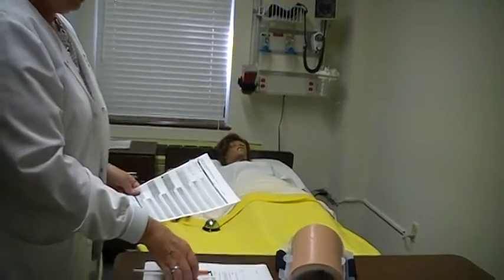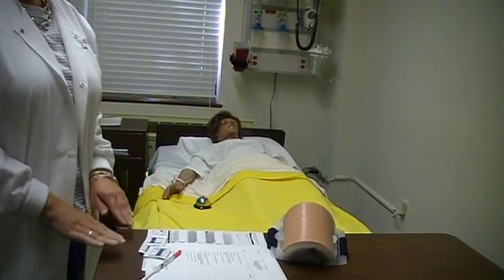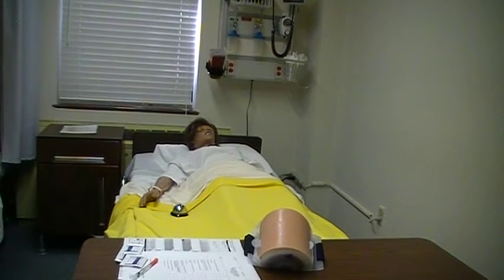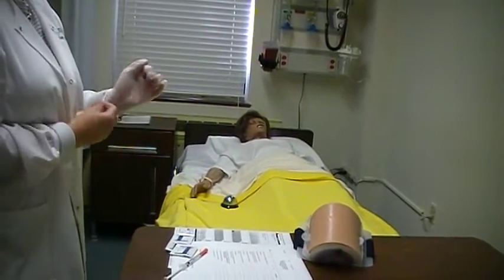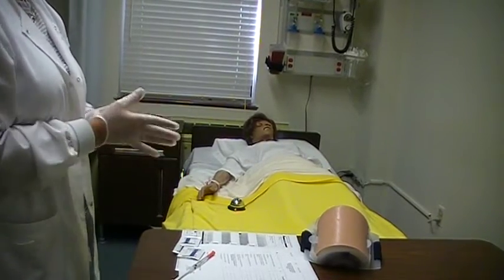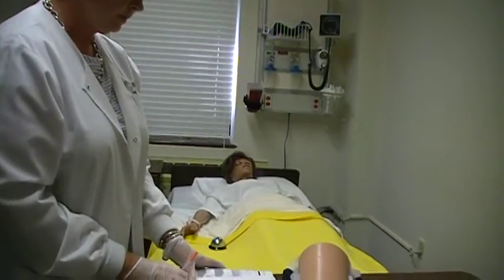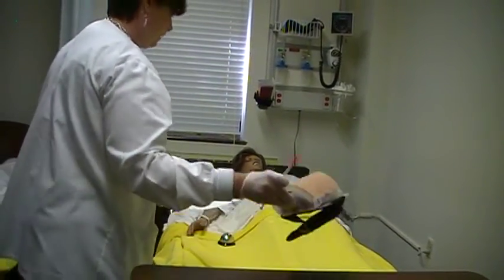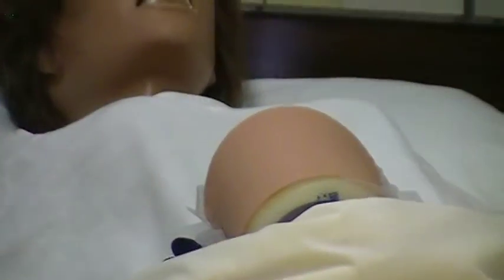Next I need to put on gloves. The medication can be laid on the table as long as it's within your sight. I'm going to grab gloves and I'm in the room, so I can still keep that medication in my sight. Step seven says choose the correct injection site and clean with alcohol. You will be required to tell the instructor the multiple sites where sub-Q injections can be given. Since we're giving insulin, we are going to use the abdomen — one inch around the belly button.